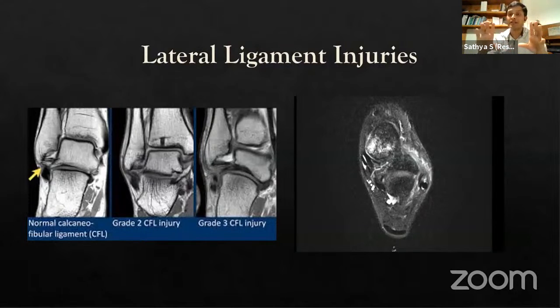you are able to differentiate a ligament injury versus any other soft tissue injury. For example, if you see a ring of fluid within this black hole here, that is partly your peroneal tendons. Then we know there could be some injury to the tendon itself if you see white lines in this area. So you are able to differentiate between a ligament presence, a soft tissue presence, a tendon presence, or some other structures like cysts forming. I hope I've answered you.